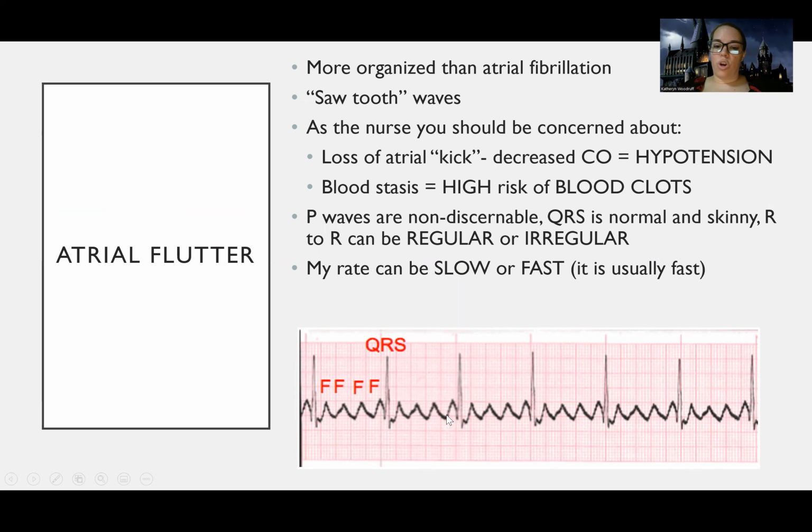So here, these are what are called sawtooth waves. You see how they're a little bit more organized. I'm going to show you a side-by-side coming up, but they're much more organized. When you're looking at these, the other one looks more like a squiggly line. These are much more discernible, but at the end of the day, it's the same problem.